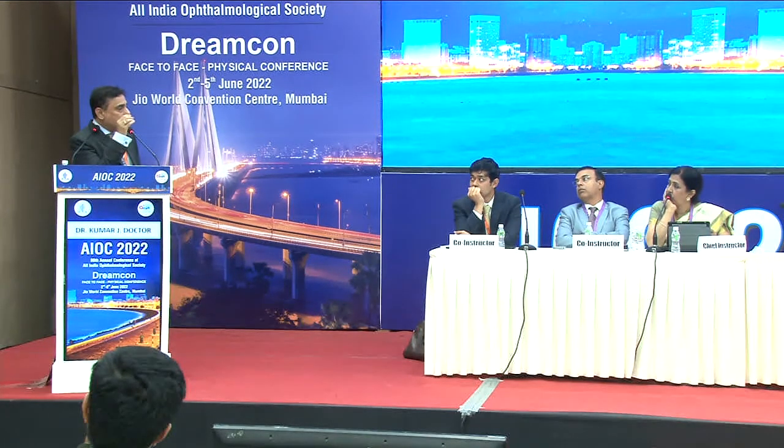So the MS39 is a machine, some of you might know, it's sold by Schwind, but it's made by CSO and it's calibrated, and it's linked to Schwind also now. Okay. So the point here is, even if you get the morphology, you have a decentered cone, say an inferior cone, best corrected is say 6/18, 6/12. I don't know that if you do an ICL in this case without doing intacts, which axis is the patient really going to land up using? Just use the refractive axis. Always. Blindly the patient will use the refractive axis.